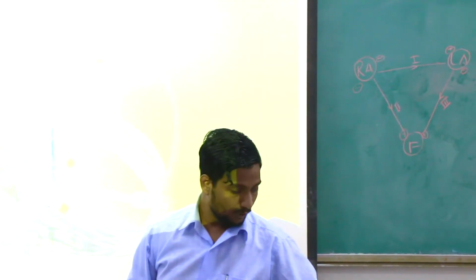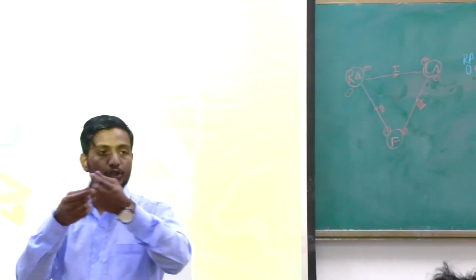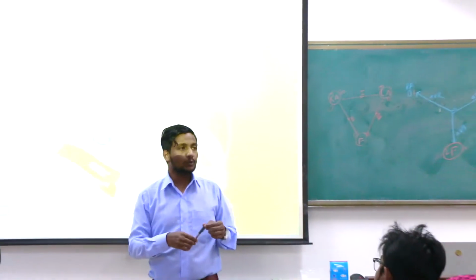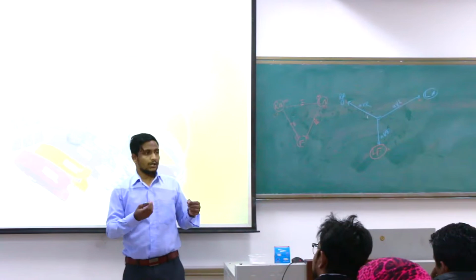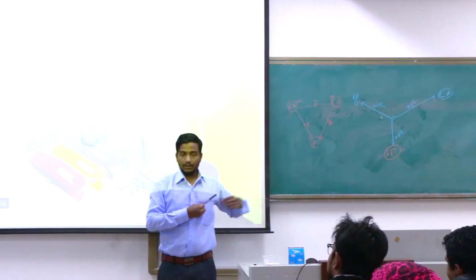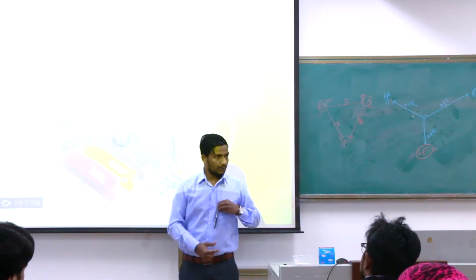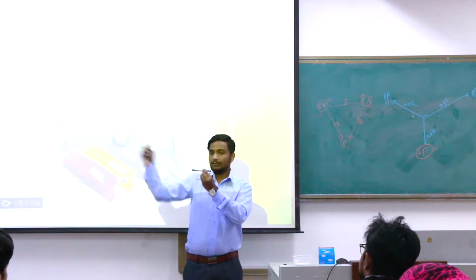So once again let me repeat. What have we learned just now? Suppose that this is the direction of the axis. So this tip is going to be the direction. And I'm going to point out and you tell me which one I'm talking about. Going from the center of my body toward my left arm. AVL. To my right arm, AVR. And to the foot, AVF. Clear to you? From the right arm to the left arm.